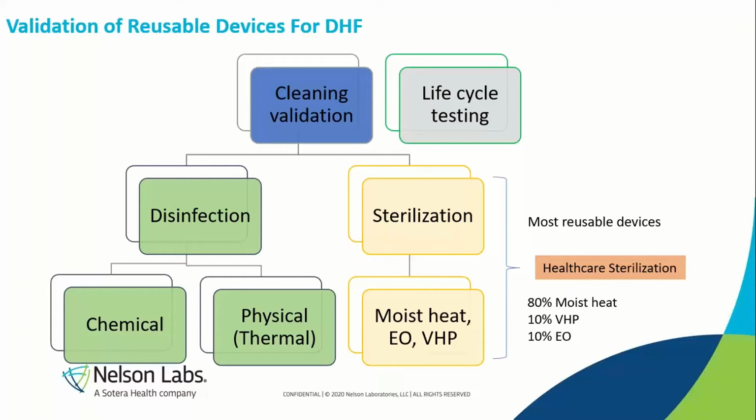So we do see more moist heat, but we often see VHP and EO, and we're seeing other modalities make it into this sector, but they haven't made it successfully to compete with moist heat so far.